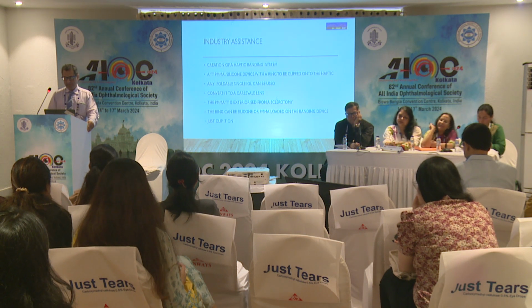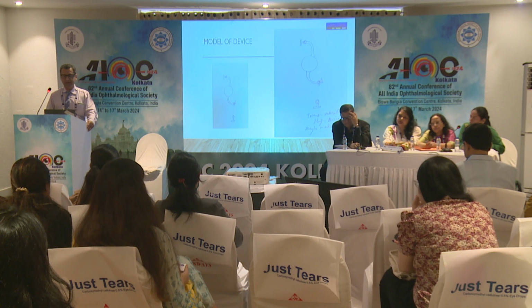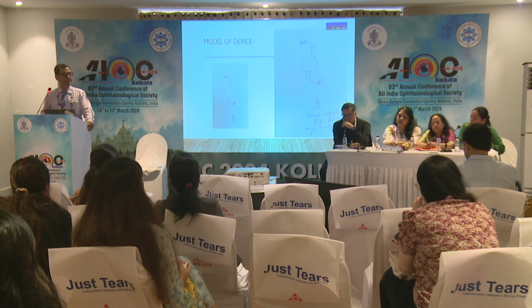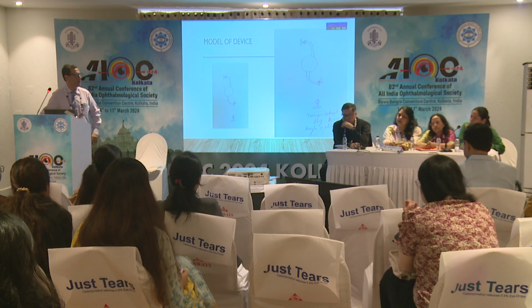So what I have thought is that with the industry's assistance, you could create a banding sort of device that you could have in your OT, and any lens you could feed into this transscleral plug device and convert your IOL into a transscleral plug IOL. Thank you very much for your patience.